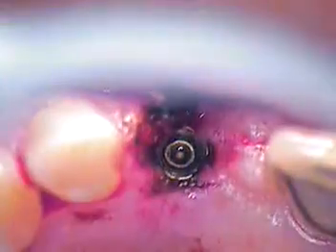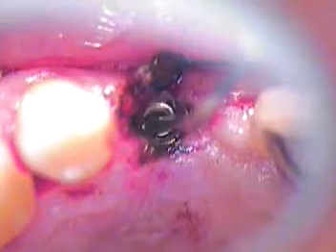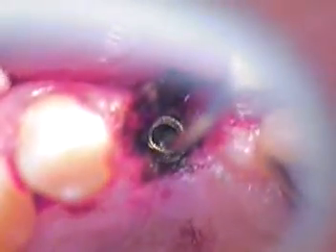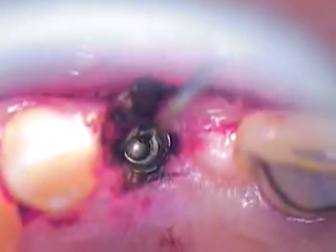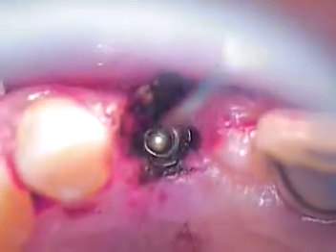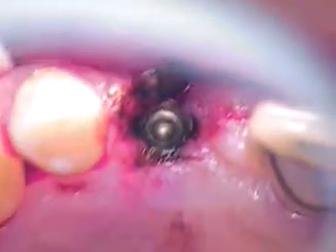So right now, some debris in there. We're going to go in with very small micro brushes. So we'll suction that out. Let me do that. Here we go. Even the suctioning, you know, this is a metal tip, so you've got to be careful. You don't want to go in on the side. You want to go right down the middle, like so. There we go. So anything that's in there comes out. Anything. Even inside of the hex itself, the little grooves, the little sharp radius of the hex angles themselves have to be cleaned.